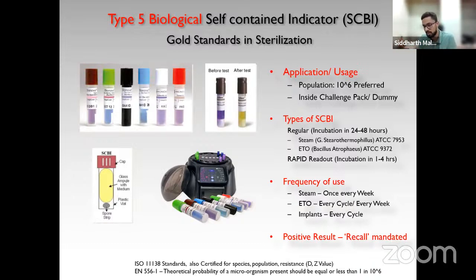That's why, as Rajendra sir suggested, there are always microbiological tests performed to see how much time the expiry of a material can be kept. So a very simple example is keeping 7 or 8 different bowls. You put some gauze pieces in that, pack it in your packaging. If you're using a drum, it is fine. If you're using a linen cloth, even that is fine. Pack all these things separately.